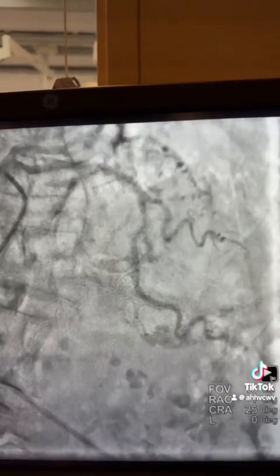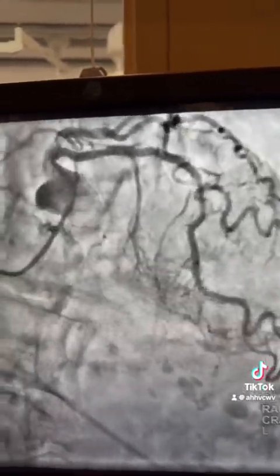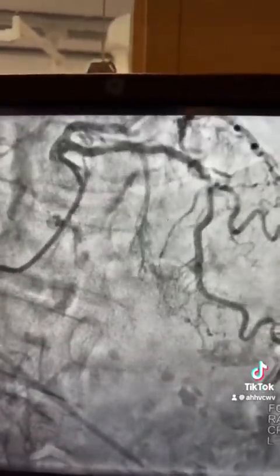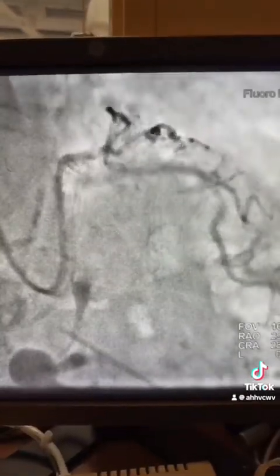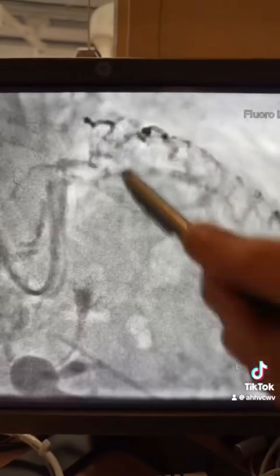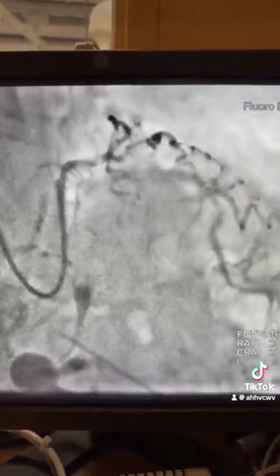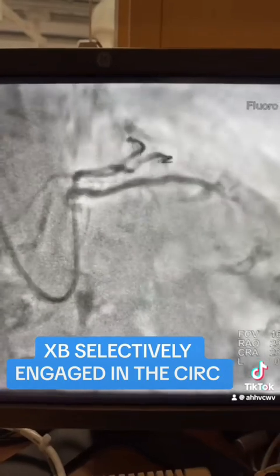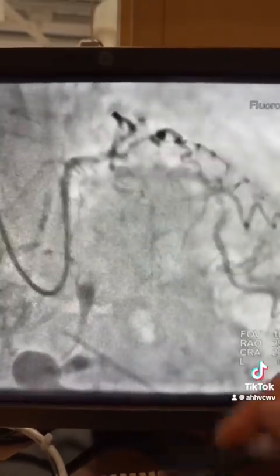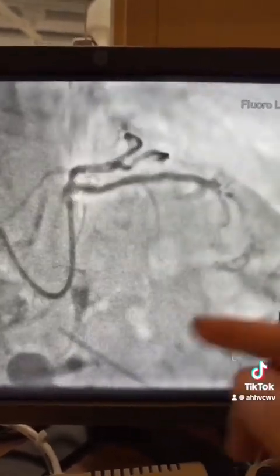As you see here, this lady is about 80-90 years old, the left main will be short. Using the XB guide, the wire went toward the circumflex as you see here — it's more engaged in the circ. So do not pull the wire, otherwise you lose the guide. Keep the wire in.